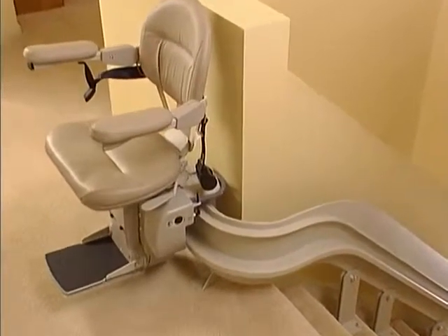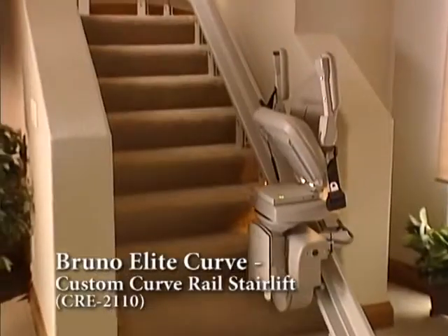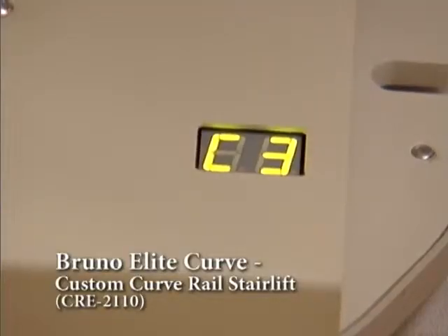Smooth. Powerful. Stable. Elegant. The Bruno Elite Curve is the most technologically advanced custom curved rail stairlift in the world.